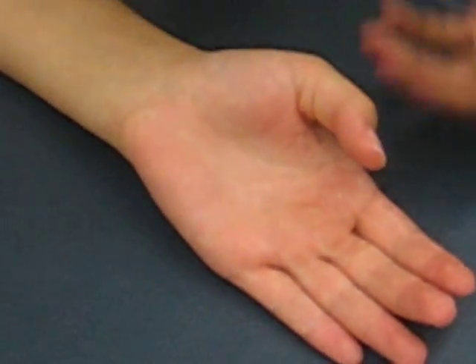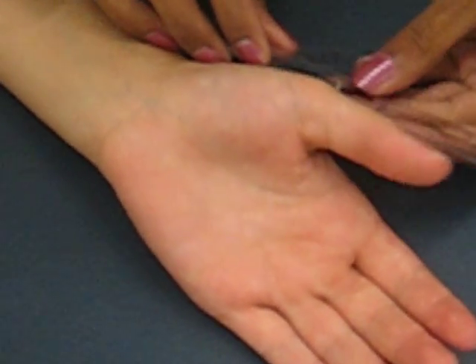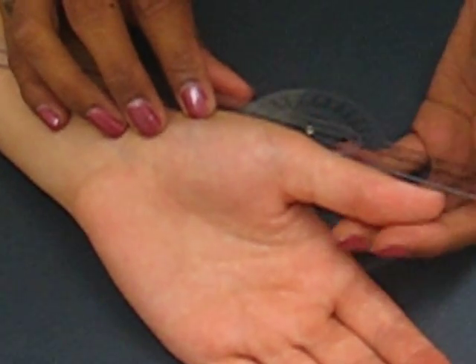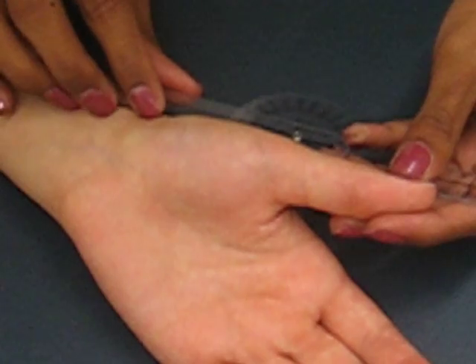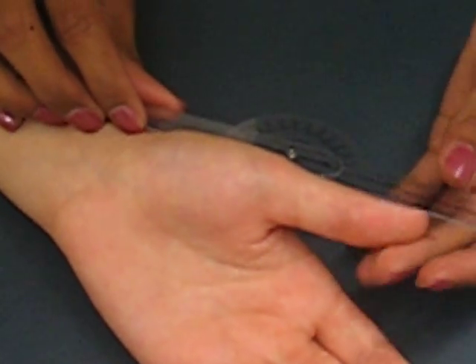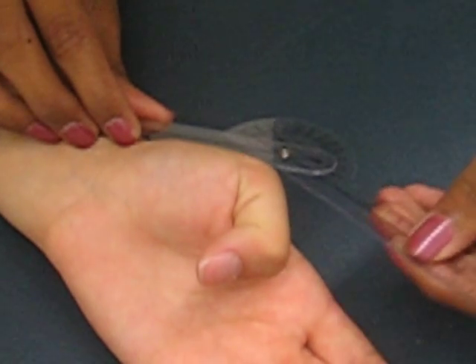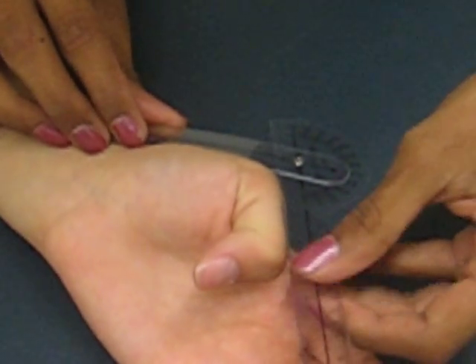So we have the axis of rotation at the MCP joint, parallel to the first metacarpal bone. We're going to start in neutral. Can you please flex your thumb in that motion? Good. Is that the furthest you can take it?